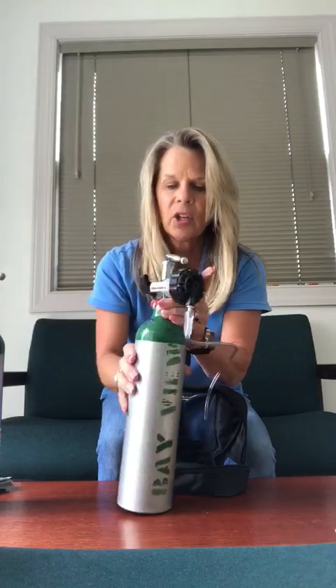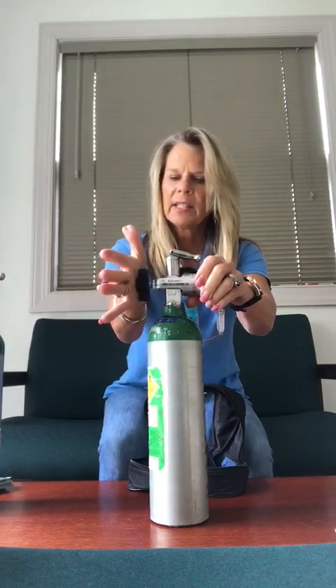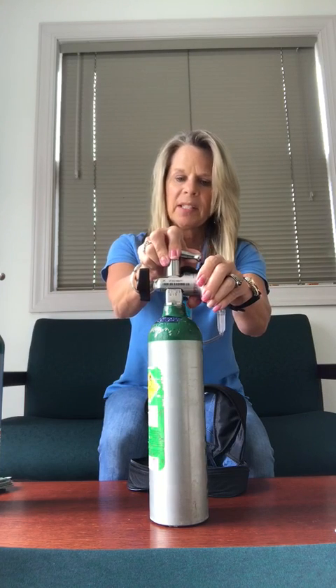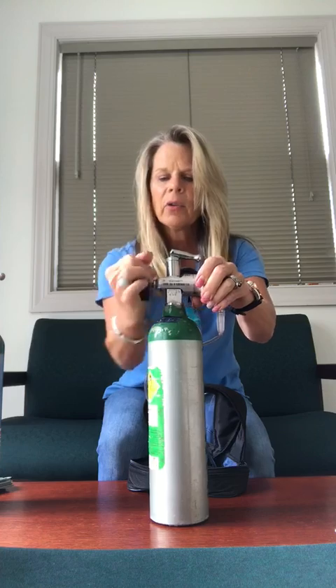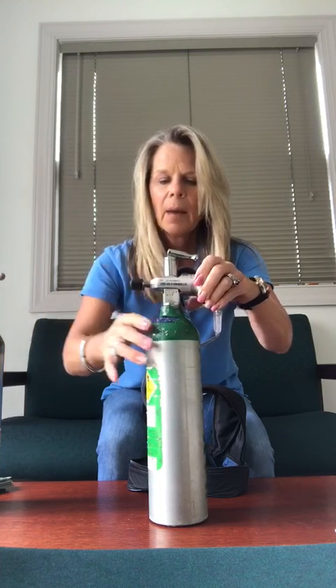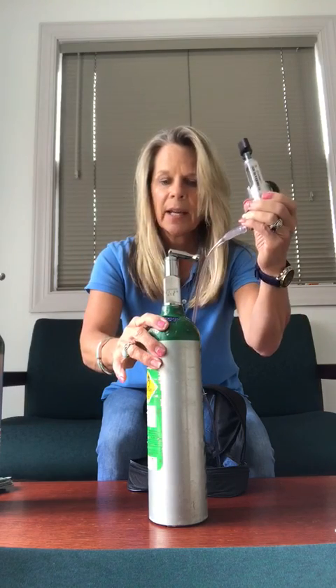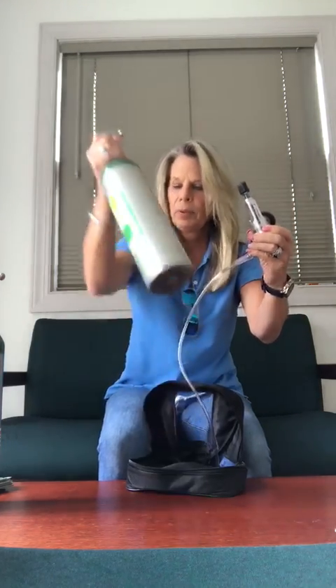Now it's time to change. I always make sure before I touch this handle that it's in the off position and I can't turn it to the left anymore. Now I'm going to unscrew the regulator, pull the pins out of the tank, and slide the regulator off. I'm going to put this aside.